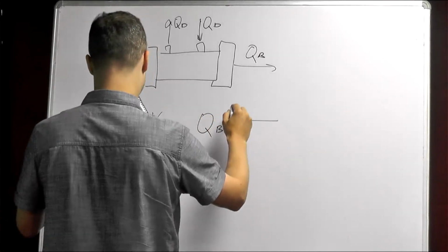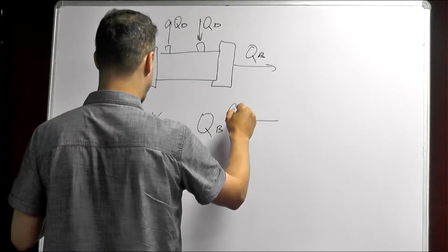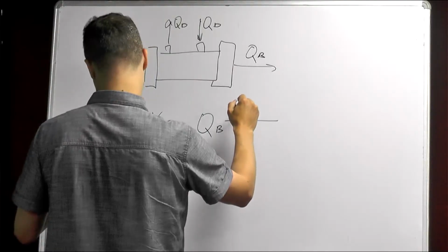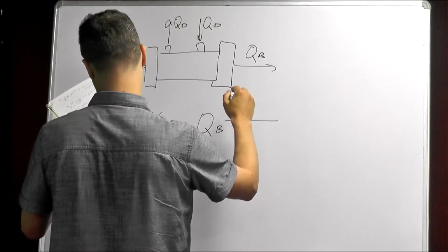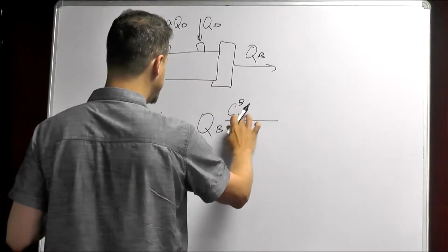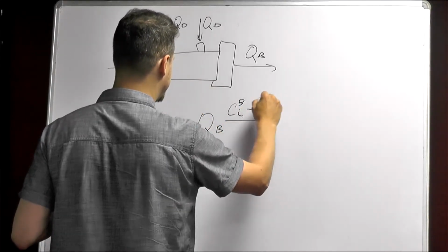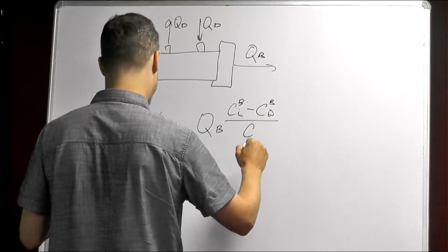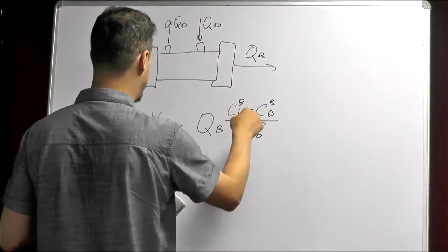It's the multiplication of the blood flow by the concentration of urea at the inlet of the apparatus minus the concentration of urea in the blood at the outlet, and there will be a concentration of this substrate in the dialyzer flow at the outlet.